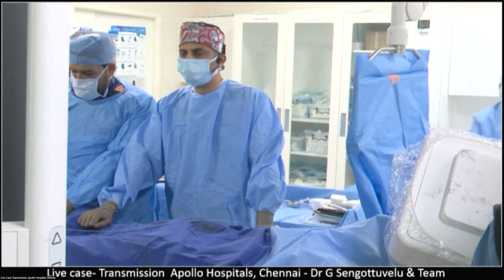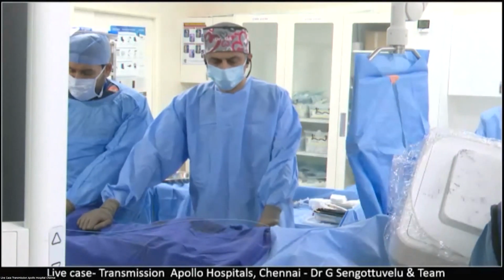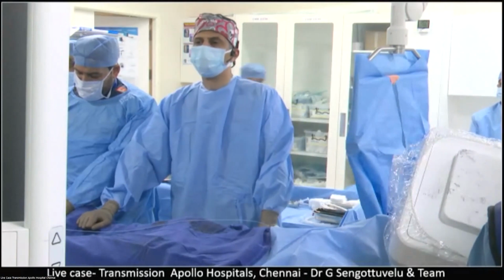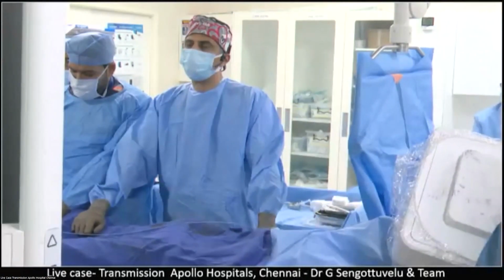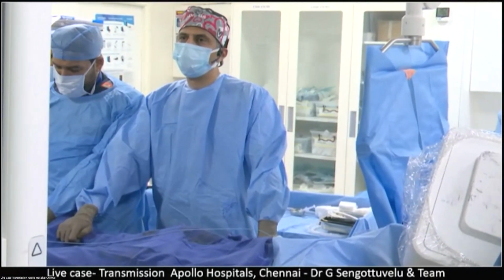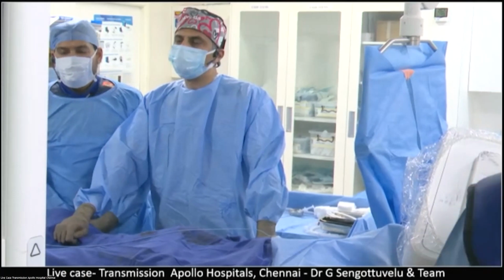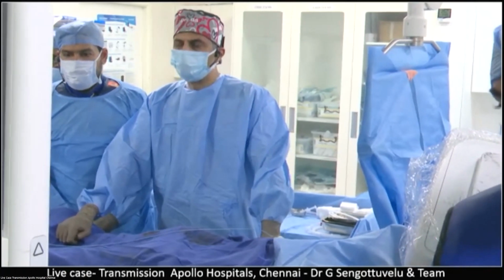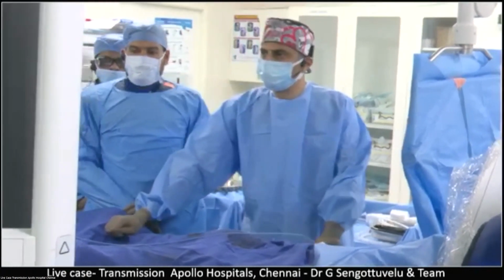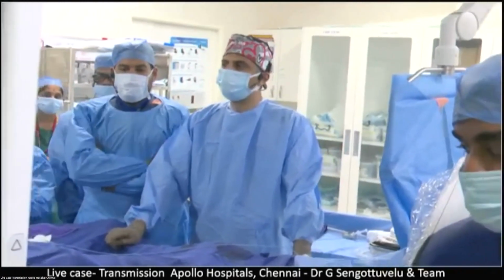Just an additional point, Sengottuvelu. Do you routinely measure the membranous septum? Because if you are going to use a self-expanding valve, this may be a pertinent point. Yes, perfect. We don't routinely measure, but particularly when you use a self-expanding valve, I think it's a good idea to measure to know the risk of conduction system disturbance.